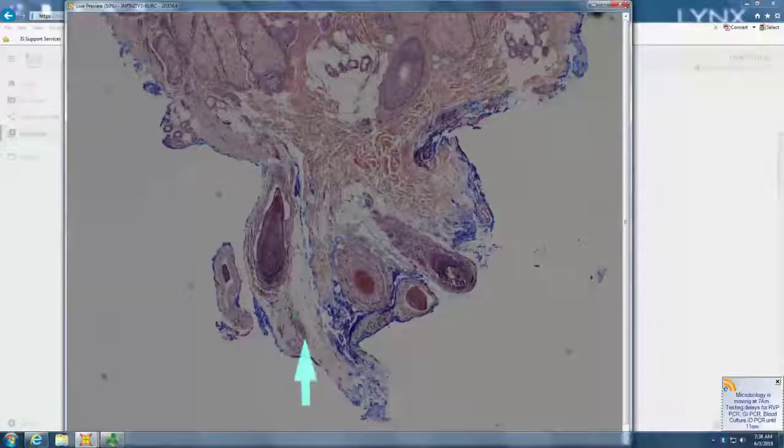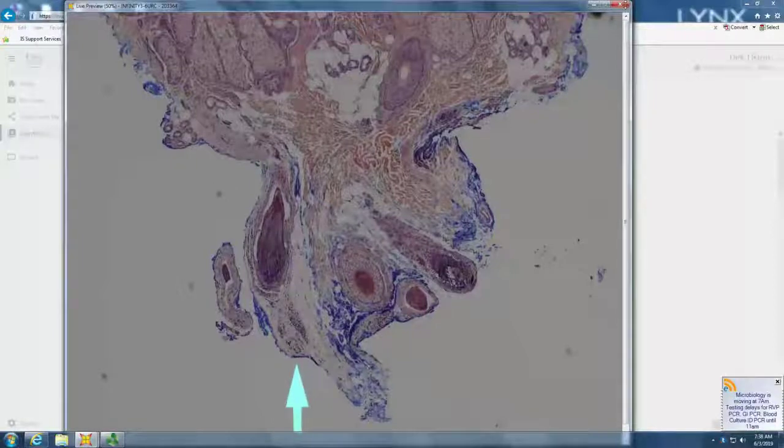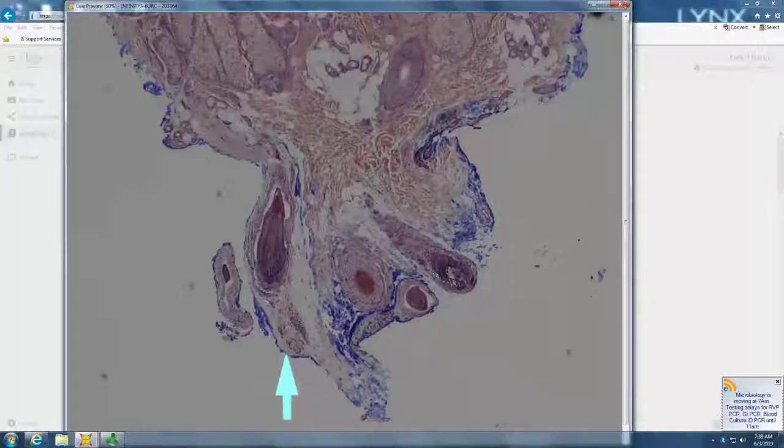And would give you some lymphocytes left in the fibrous tract and a little pigment left in the fibrous tract and maybe some eos in the fibrous tract. Trichotillomania has multiple catagen hairs, hair casts, but doesn't tend to give you pigment or inflammatory cells in the fibrous tract. Whereas a histologic look-alike for trichotillomania, alopecia areata, AA. So AA is characterized by miniaturization.